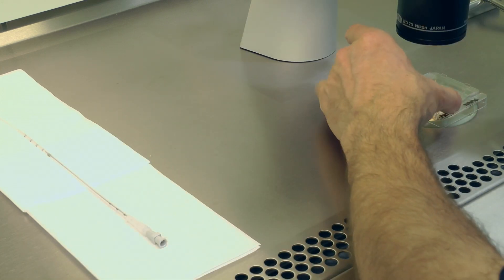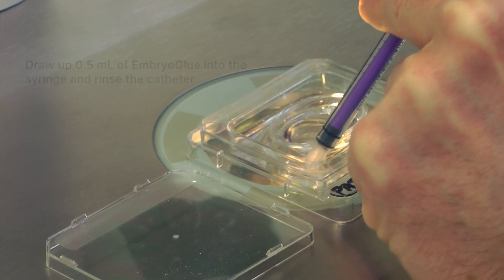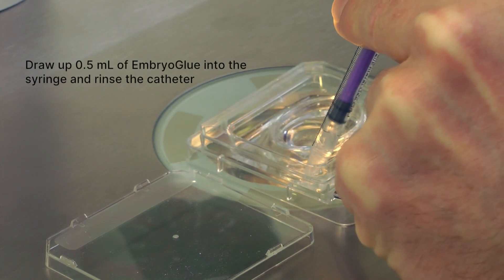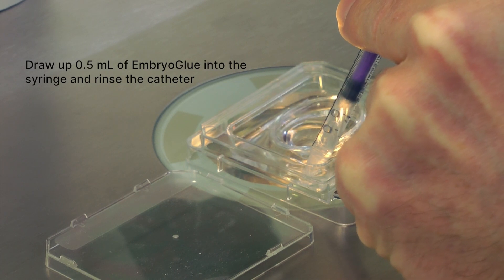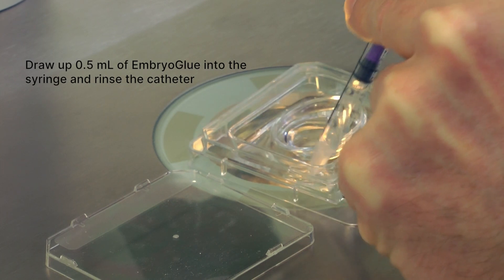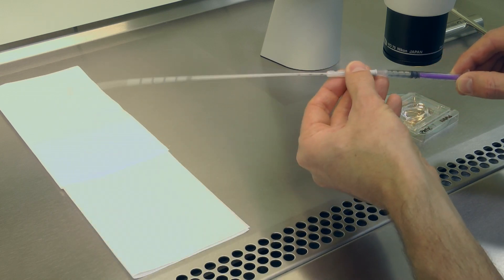Prepare your syringe and Embryo Transfer catheter. Rinse a 1 ml non-toxic syringe by aspirating Embryo Glue from the moat several times until no air bubbles are observed in the syringe. Attach the syringe to the catheter and flush the catheter through in the moat of the dish.